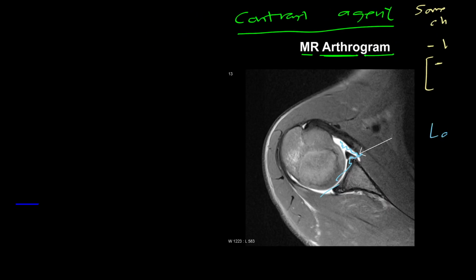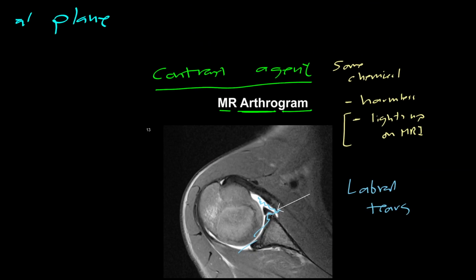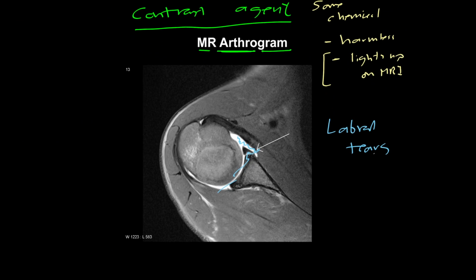So that's MRI. Super detailed, pretty slow, pretty expensive, but no ionizing radiation. So probably, beyond your typical, you walk in the clinic and they give you an X-ray, the MRI is usually the next step, and we'll use them in this class for imaging things like muscles, tendons, ligaments, and so on.